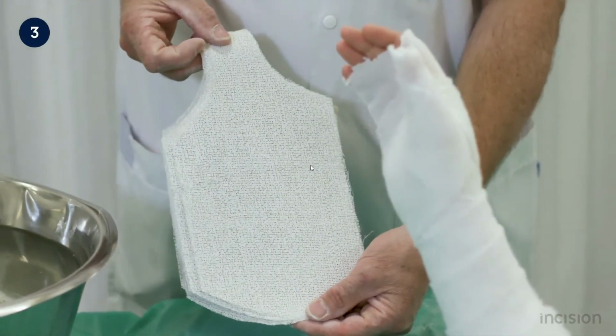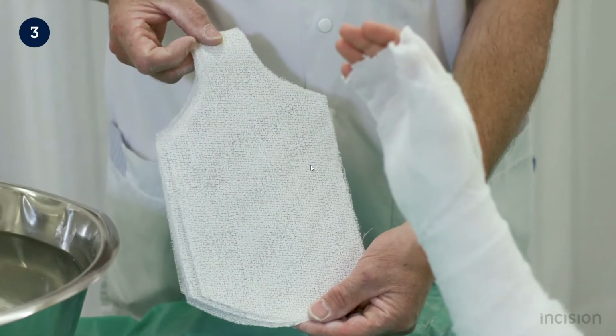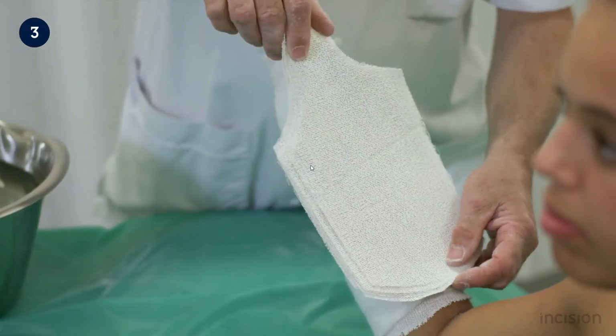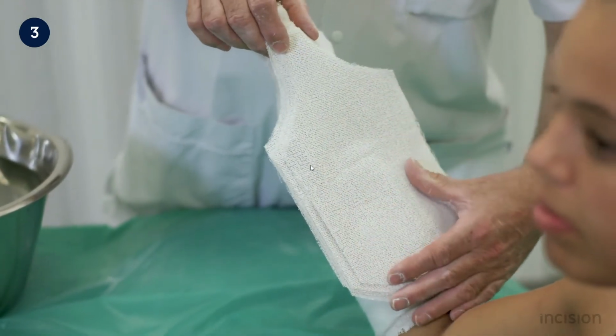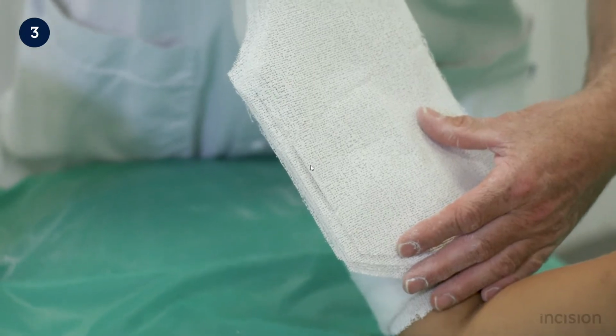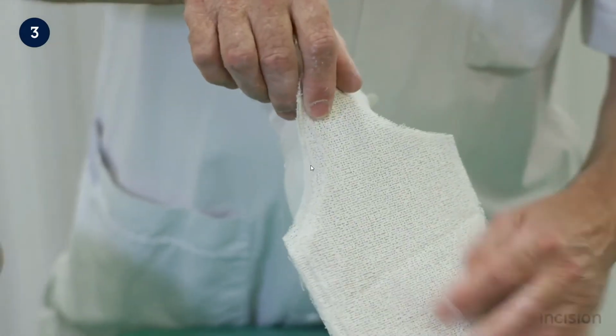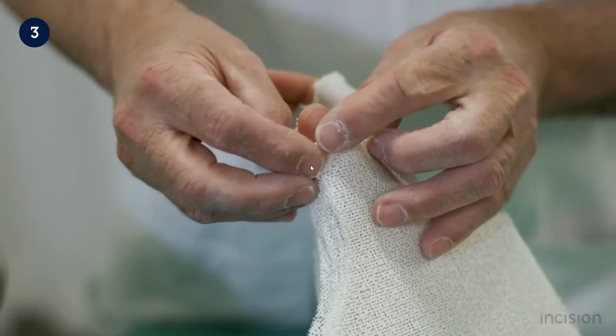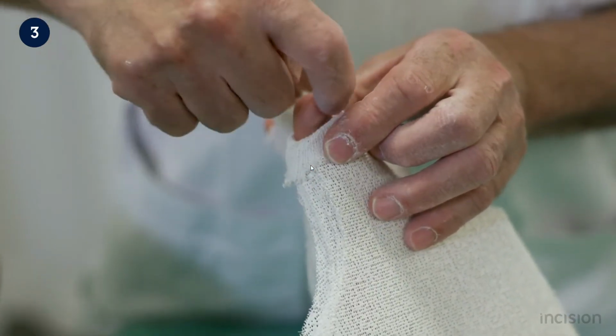For a thumb spica splint, a bottle-shaped piece of plaster can be used. How the plaster will be applied while dry is demonstrated. The plaster should be applied 2 finger breadths from the elbow crease along the radial side of the arm and wrist joint. The narrow piece will support the thumb while taking care that the nail of the thumb is exposed after the application, as demonstrated here.